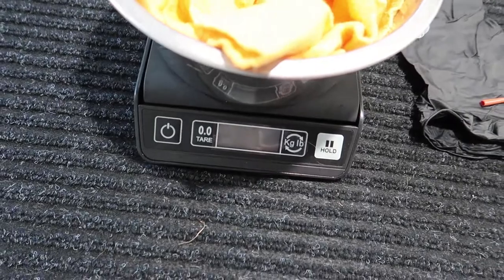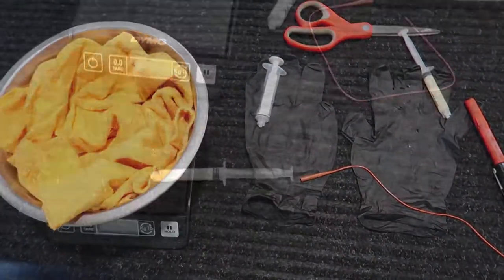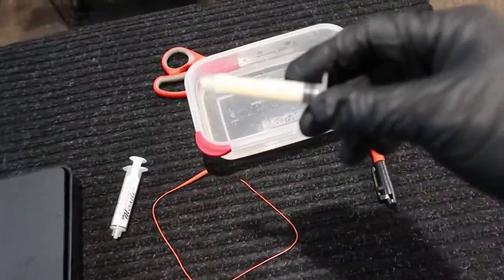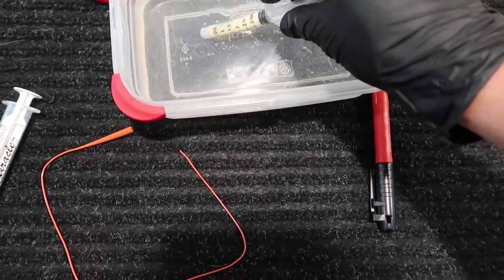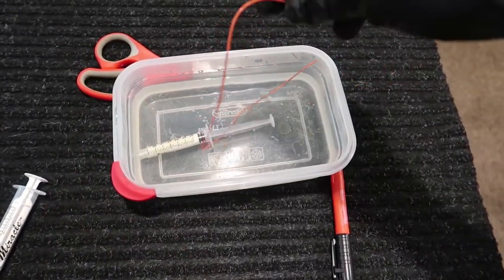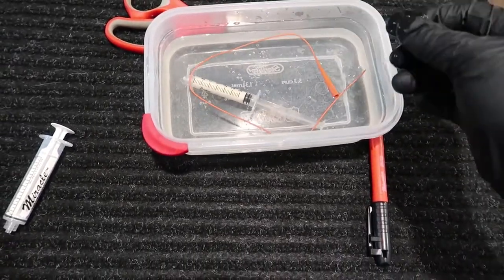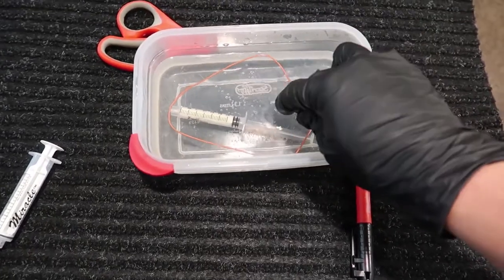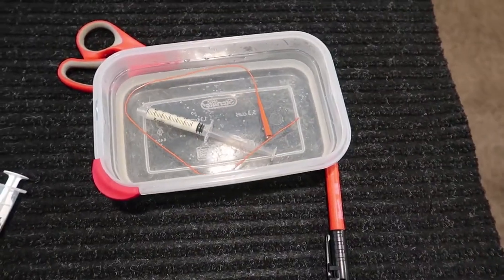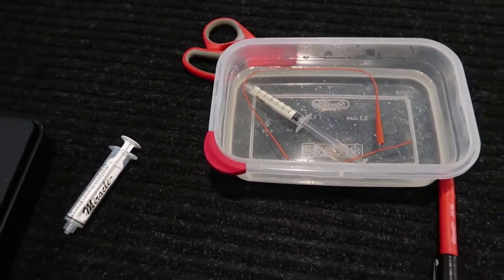Measure how much the puppy weighs. First thing you want to do: warm up the frozen milk and throw your catheter in there to warm it up, so it gets soft when you feed the puppy. It won't be rough going inside the mouth. Warm that up first, and we'll weigh the puppy while we let that warm up.